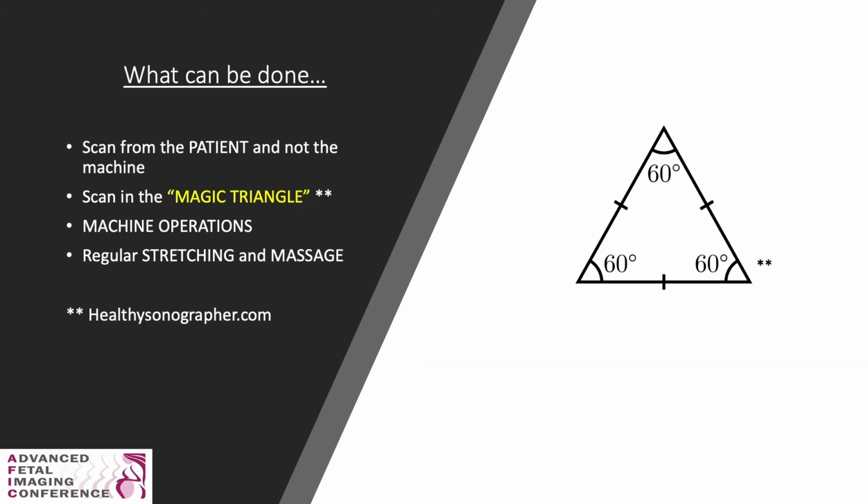So what can we do about it? It's so important to scan from the patient and not the machine. So many of us are guilty of setting up the room before going in to get the patient. Then we might move the bed up and down and call it a day. To achieve good ergonomics, it is absolutely crucial to set up your machine after the patient is positioned on the bed for the exam, then and only then. I must admit I'm totally guilty of a pre-set up room based on my exam and not my patient.